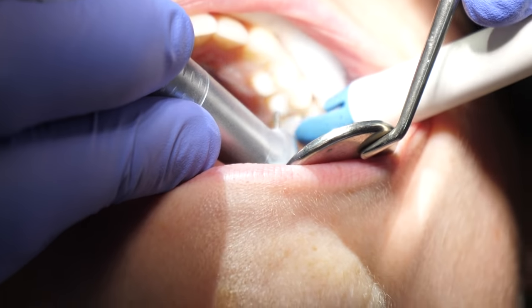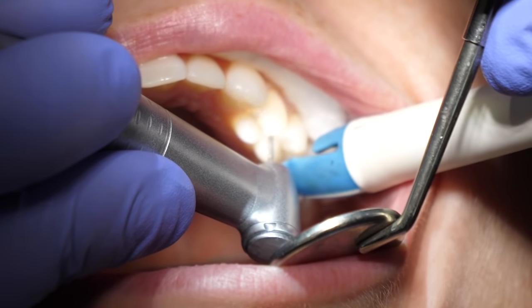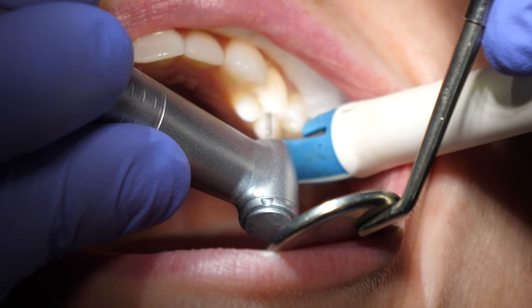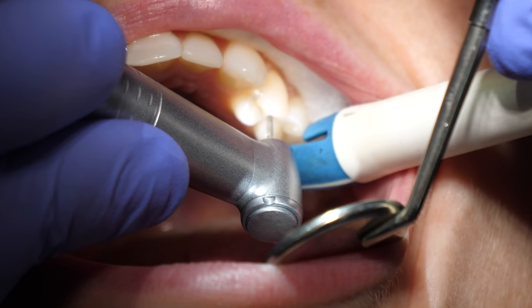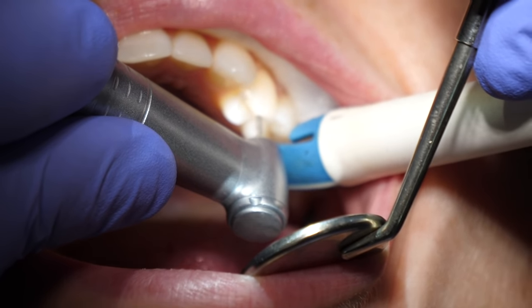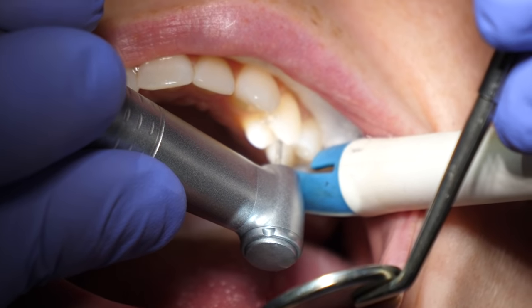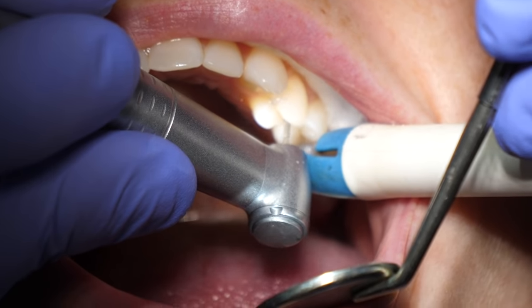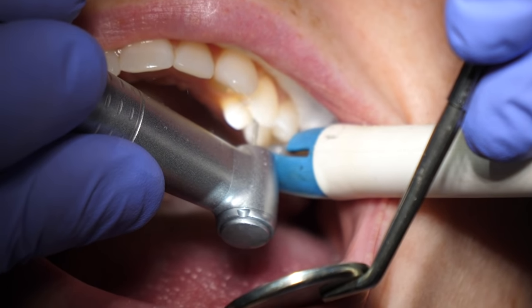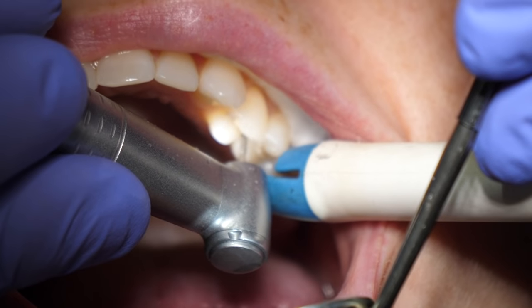Once you're numb, the next step is to use a drill or an air abrasion instrument or a laser to remove the decayed area. In this case, the dentist is using a drill to remove the decay, aka the cavity, out of the tooth, starting with a high-speed handpiece. This specific high-speed handpiece drill sprays out water, so there will also be a suction and/or a saliva ejector in the patient's mouth during the drilling to suction up the water.